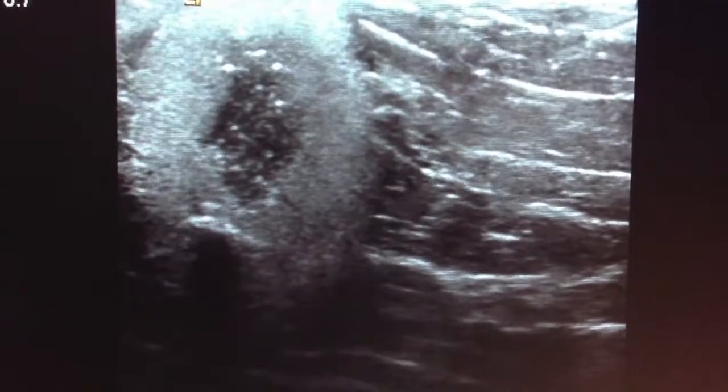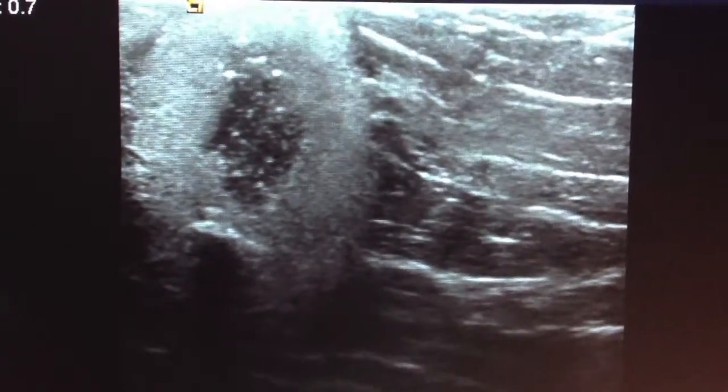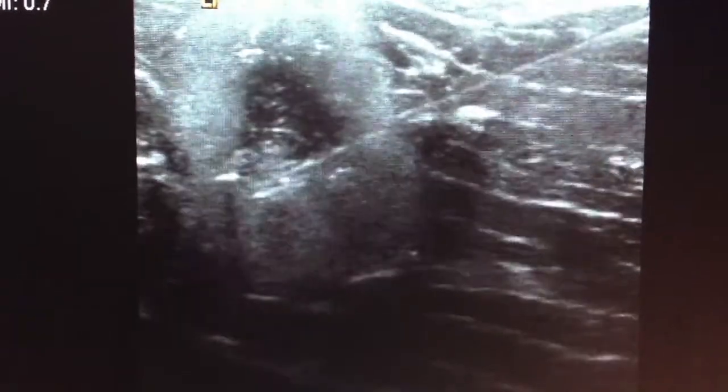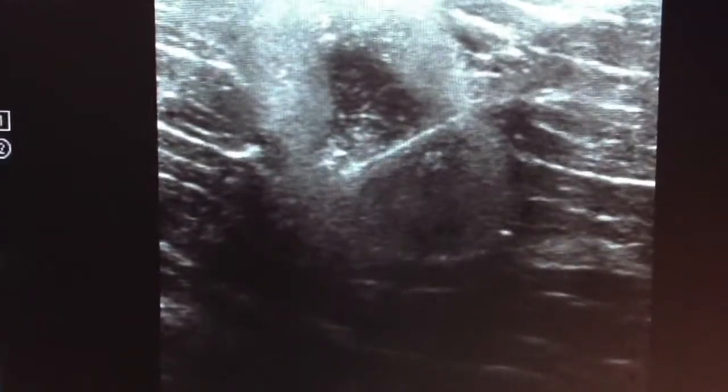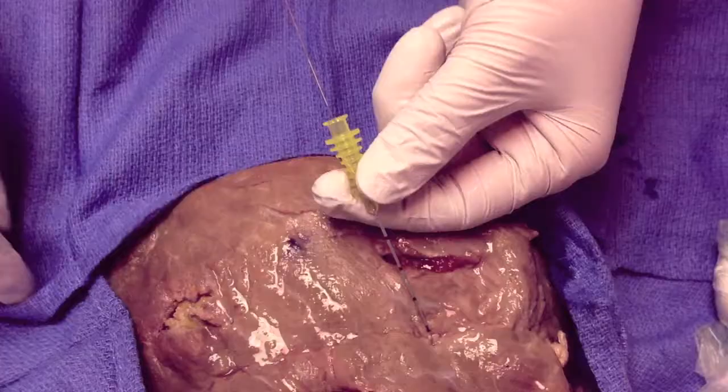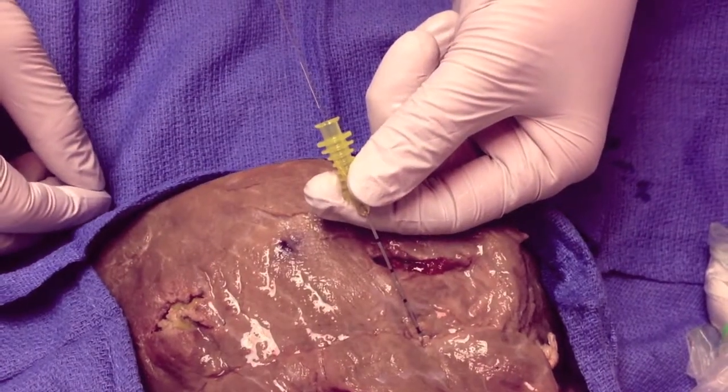Here we are — here's her needle on the right-hand side of the screen aiming towards our lesion. She's going straight through the middle of the lesion. We want to make sure that we're about 5 to 10 millimeters on the other side of the lesion. Always want to check your tip very carefully because the angles are pretty steep. There we go — that's nicely there. Now while it's in that position, here we have our needle in the lesion.